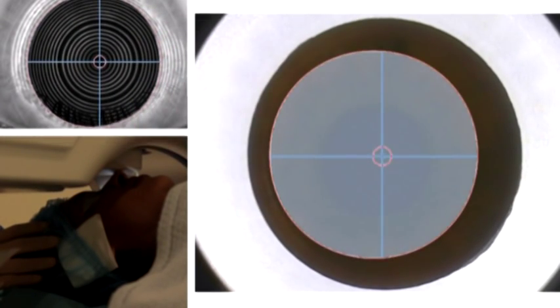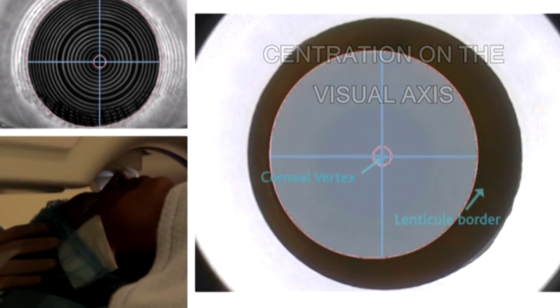A combination of the surgeon's coaxial view and the patient's fixation results in optimal centration on the visual axis, which is verified using an infrared illumination system.